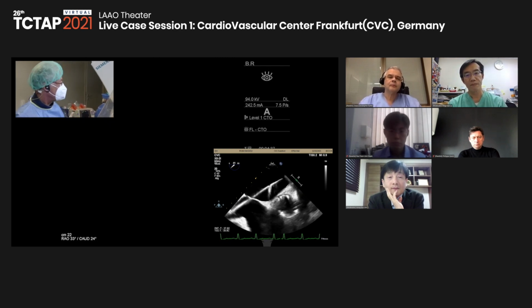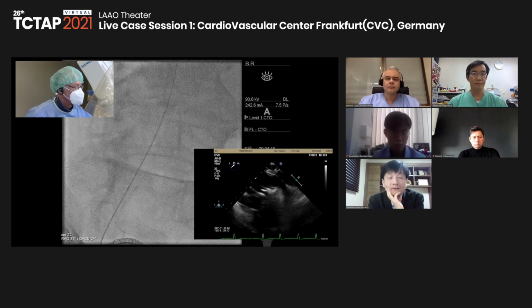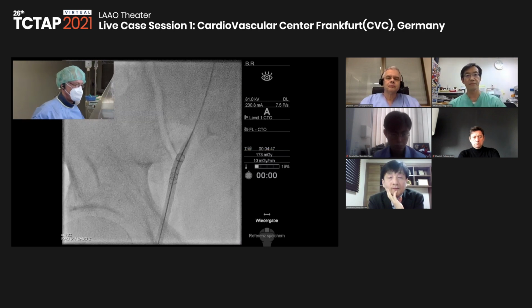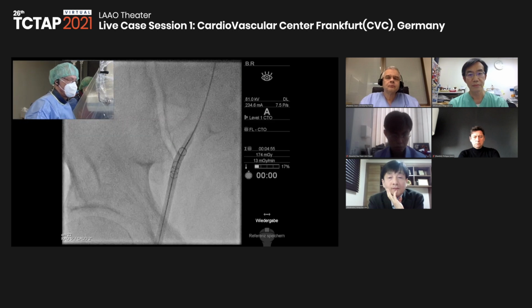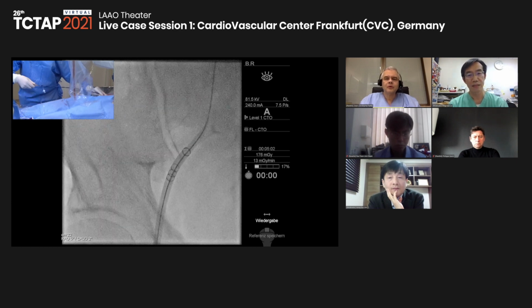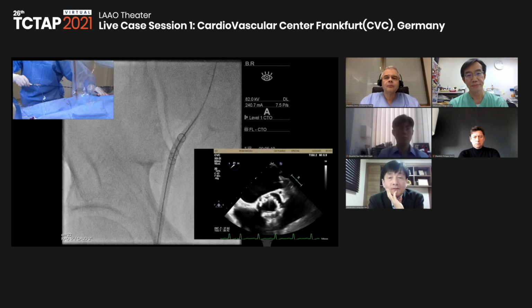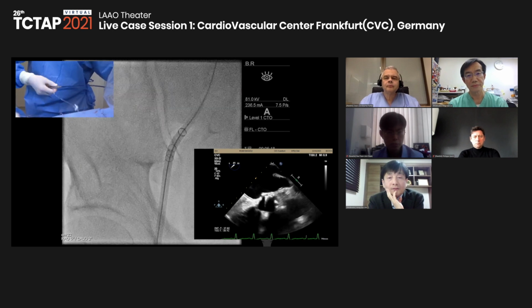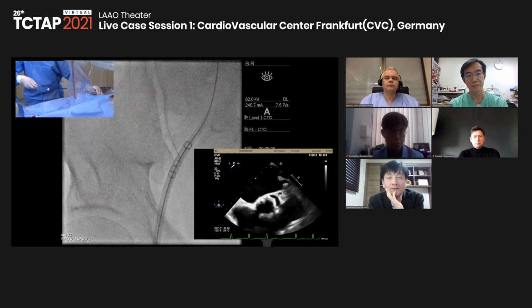I have a problem in the groin here. Let me check what's going on. Be careful. Interesting, huh? Yeah, it's a bit tortuous there. Julia, maybe we need a bigger sheath, probably the 16 French sheath.